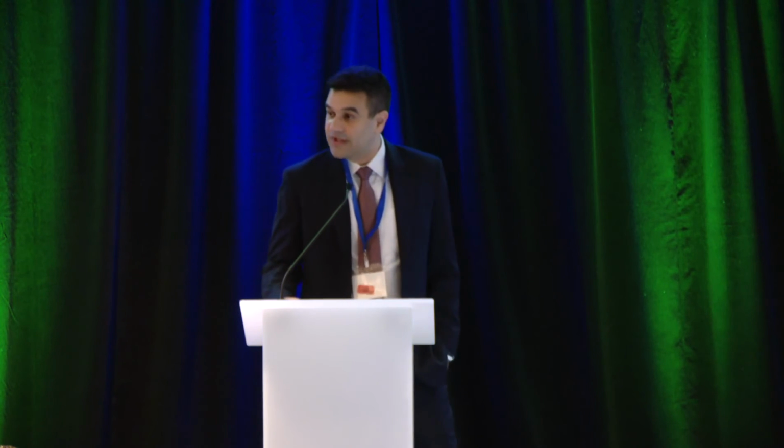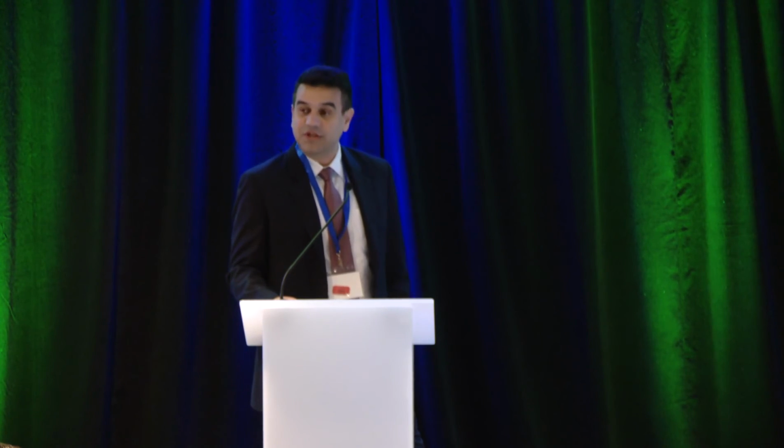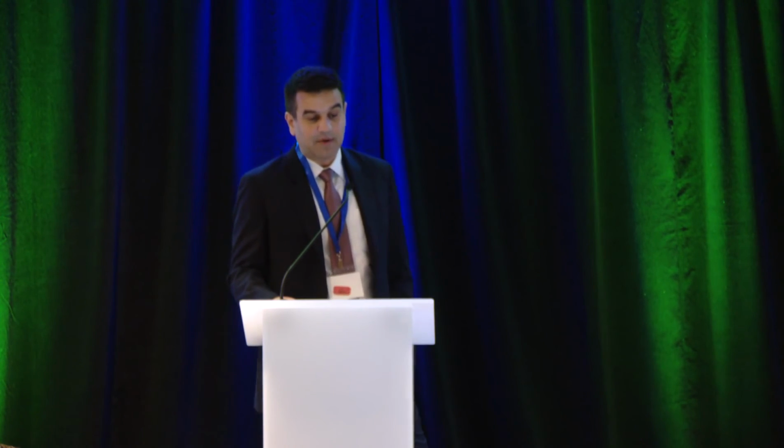Now, I'm going to be referring to a lot of these clinical algorithms, which are paired with these technical reviews, and they're all out at this point. So I encourage you to read these, because not only does it go through what I just mentioned for achalasia, and you'll see it goes through a lot of things with inconclusive disorders for the other disorders, it also tells you how to think about this in a practical context and even implies what you should do with treatment. You see there on the left, in your conclusive achalasia diagnoses, it talks about definitive treatment options for type 1, 2, and 3. And then if you have inconclusive diagnoses, it typically is going to request that you do a timed barium esophagram or FLIP to really strengthen your diagnosis.